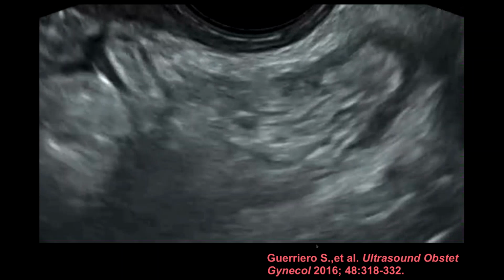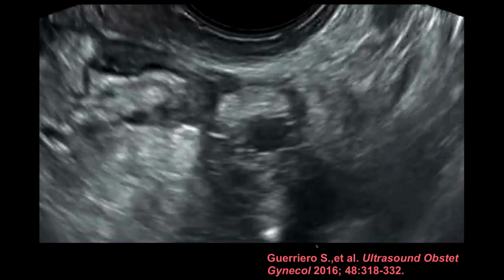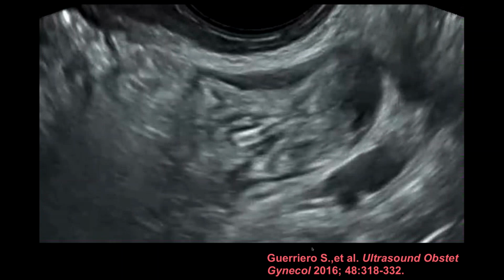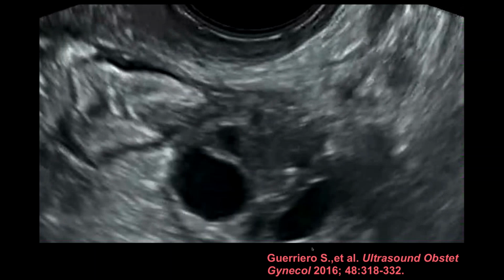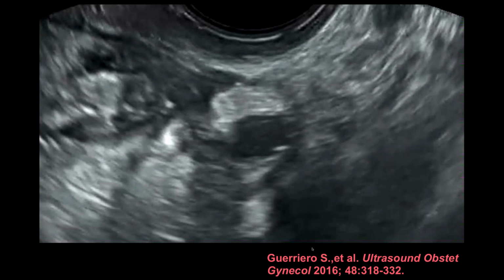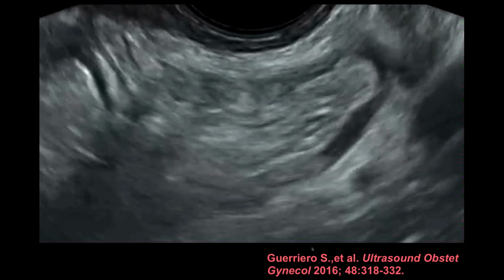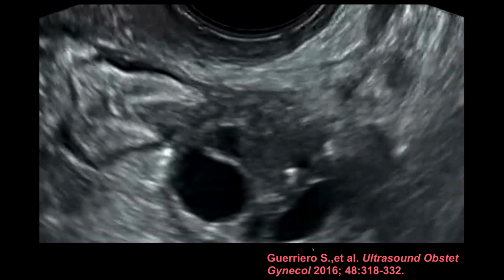Again, this is very significant because if this patient, for example, also has an endometrioma and goes to surgery, and the provider who's going to be doing the surgery isn't aware that the patient also has deep infiltrating endometriosis, bowel is plastered, perhaps the posterior cul-de-sac is obliterated, when they go in, they may not be prepared for what they find, and there's nothing worse than taking a patient to the OR and then having to get out because you're in over your head.